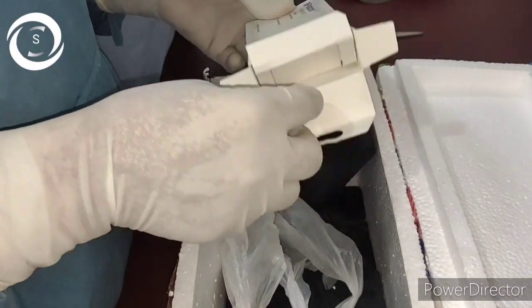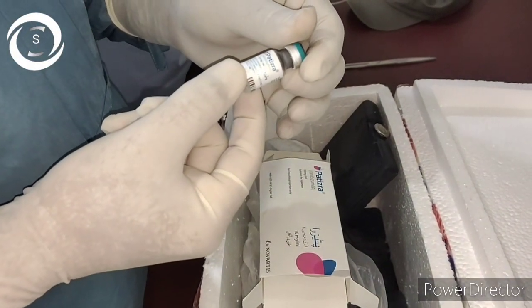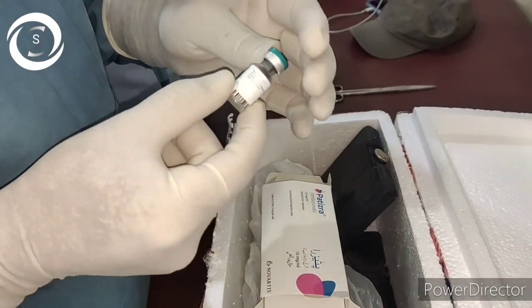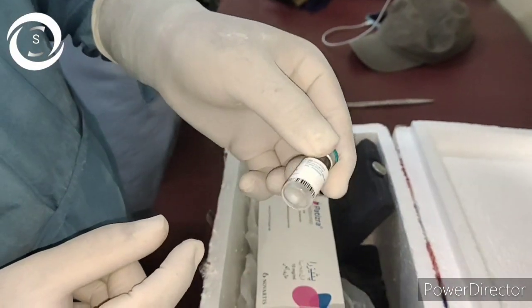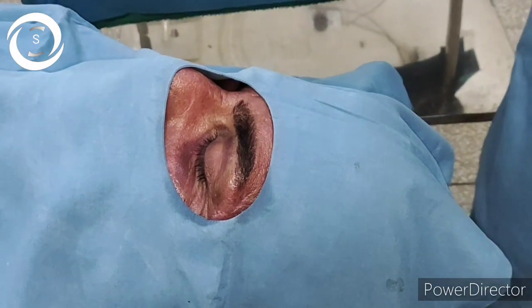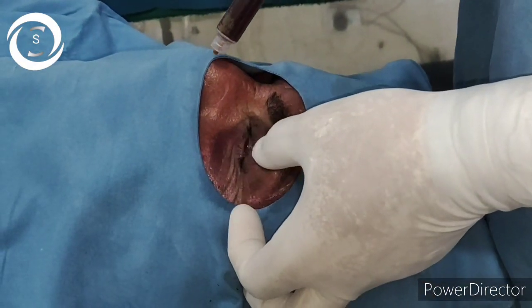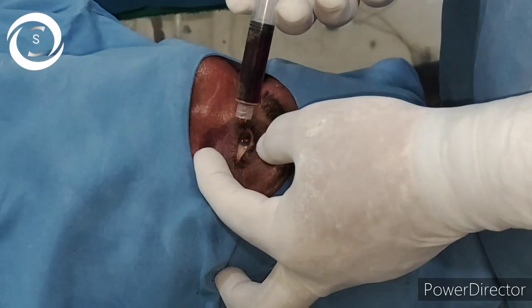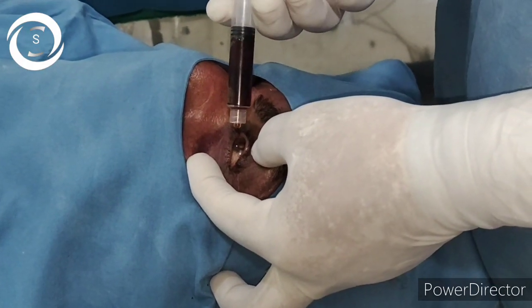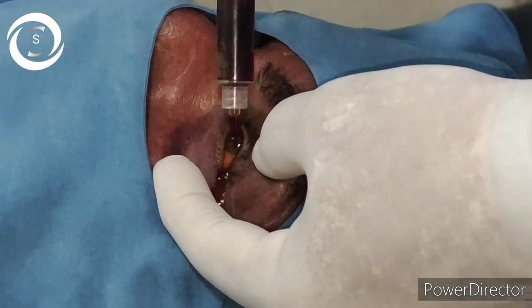Then you can perform with or without eyelid speculum. I use eyelid speculum to avoid needle contamination by the lashes via involuntary reflex lid closure during needle entry. You can also apply a mask or go without a mask, but studies have shown that the incidence is equal with or without mask. So it's your personal choice.